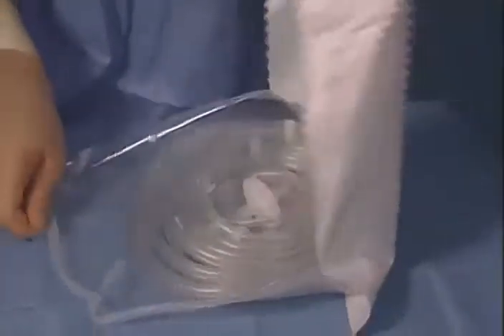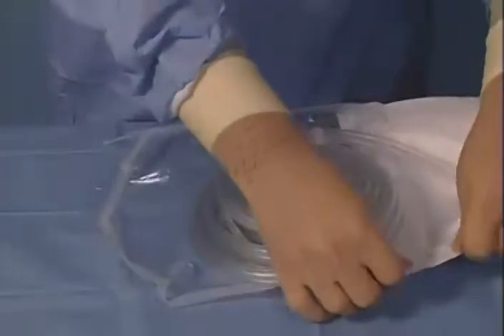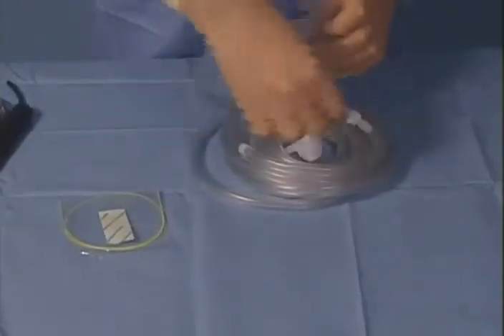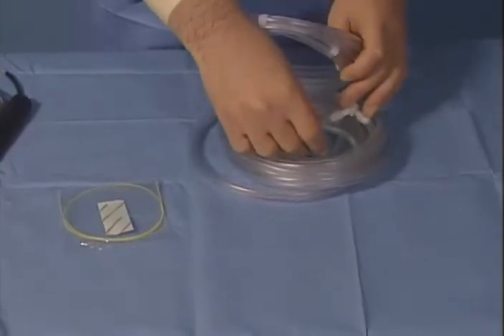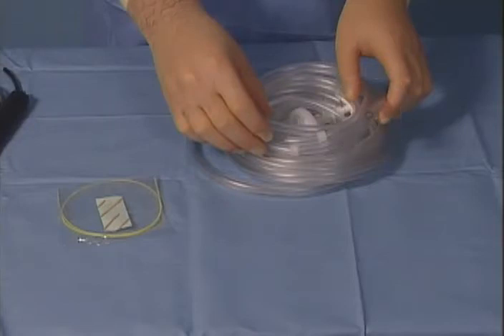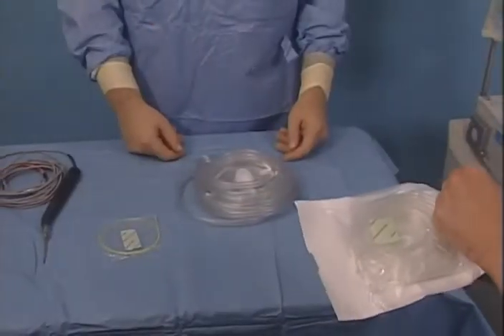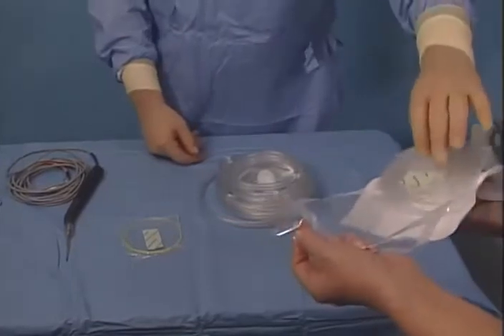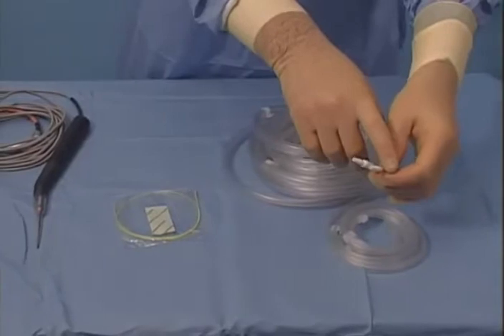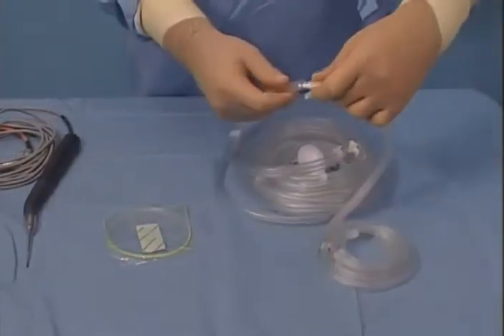Open the selector tubing kit onto the sterile field. The kit contains a sterile tubing kit, hose clips, and a stylet. Remove the tubing kit from the wrapper and turn the tubing kit over onto the table. Locate the double lumen tubing from the center of the sterile tubing kit and connect to the irrigation and aspiration ports on the back of handpiece. If using the 24 microsurgical handpiece, open micro tubing kit and attach open end of double lumen tubing to the standard selector tubing kit.